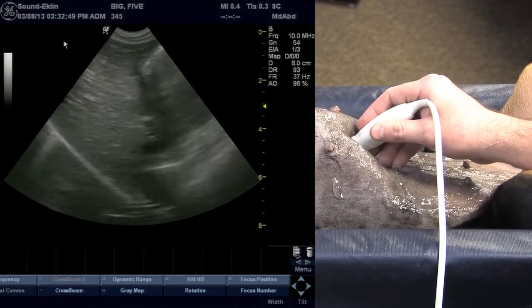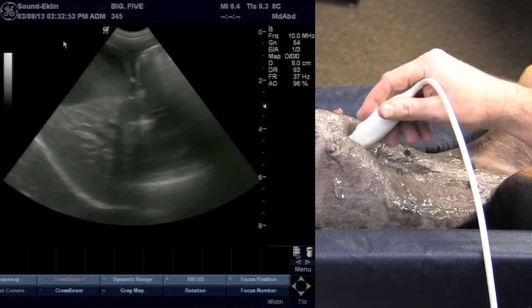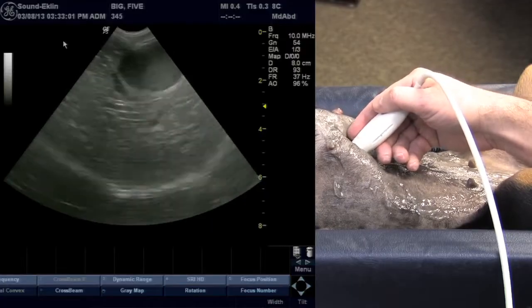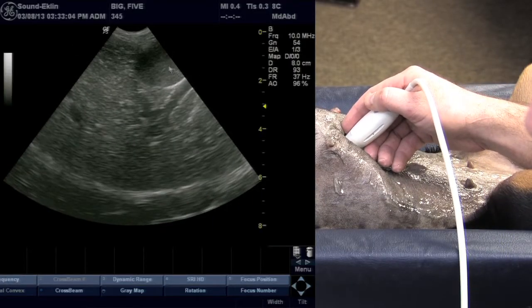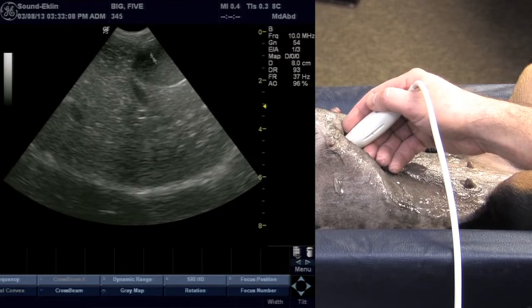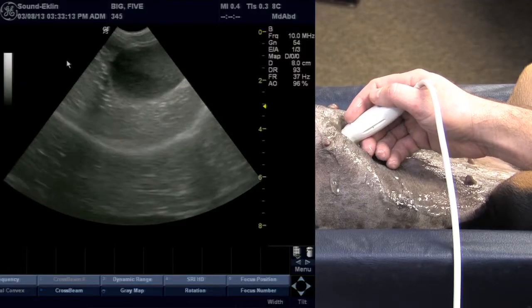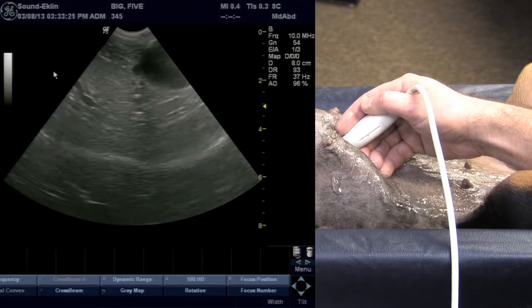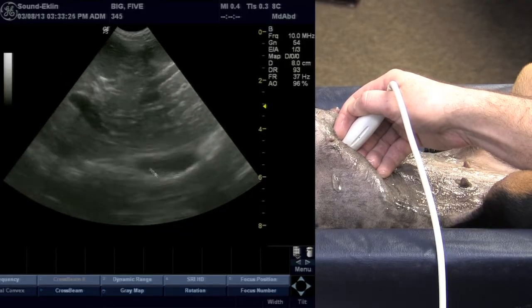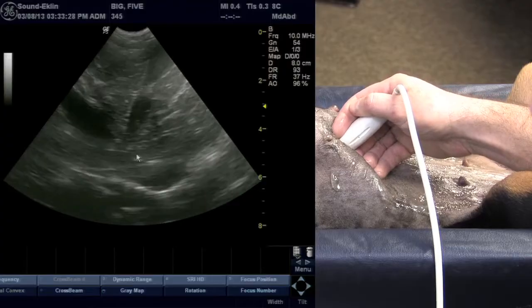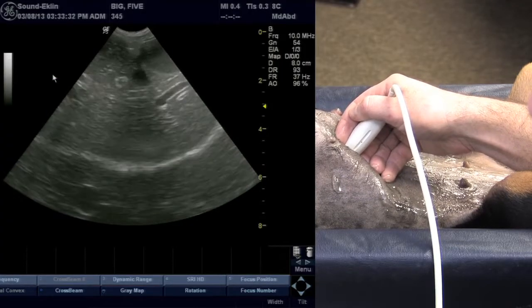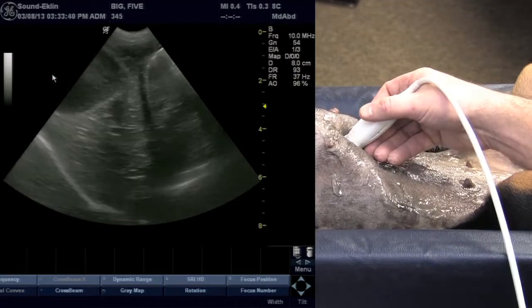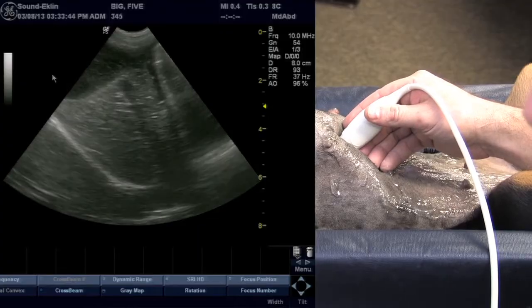As we come back towards midline, I'm going to take the probe and rotate into a transverse plane. I'll put the reference marker towards the left — we always position things on the ultrasound so that left is on the right side of the screen and right is on the left side of the screen. We can see the gallbladder in this transverse view. From this position I fan the probe, taking the head of the probe towards the spine and gradually lifting the tail to sweep through the liver in a transverse plane. This puts me into the area of the porta hepatis where we can see the hepatic vein and portal vein, then we'll sweep back up towards the ventral surface of the liver.